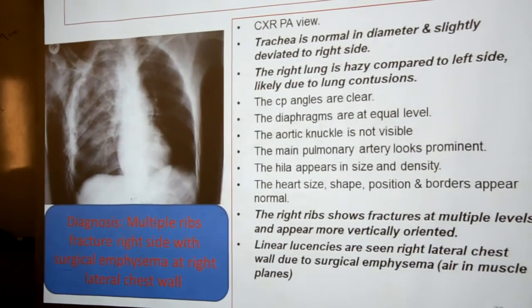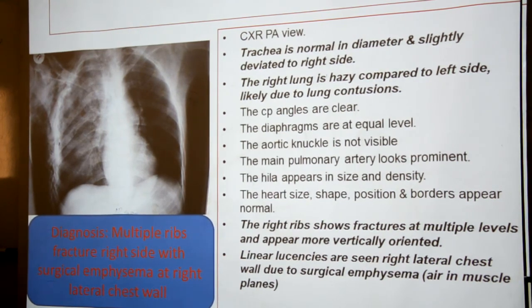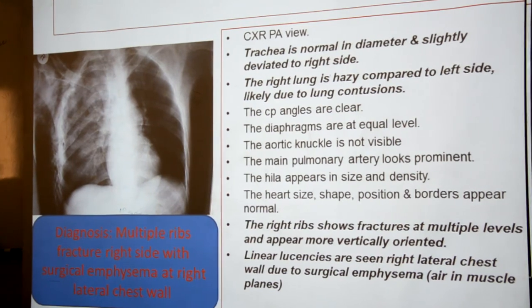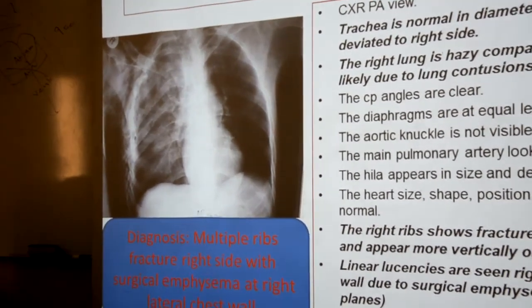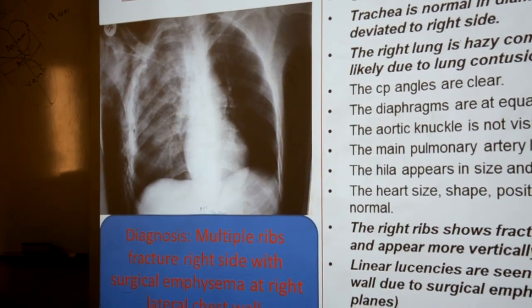Okay, let's take another case here. Now this is the same film which I have already shown. I expect you to show your skills in the exam. Okay, how? Chest X-ray, PA view, taken in emergency situations.